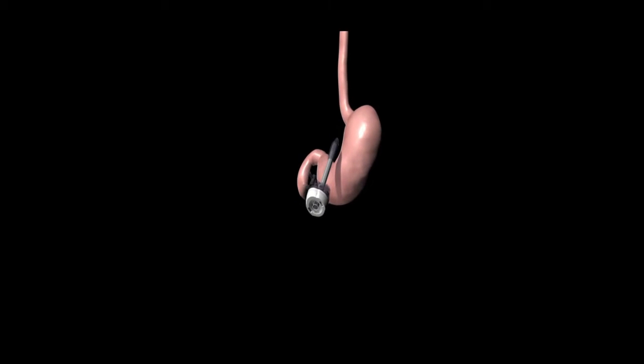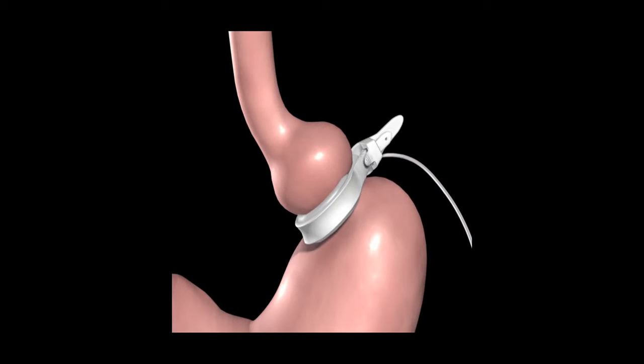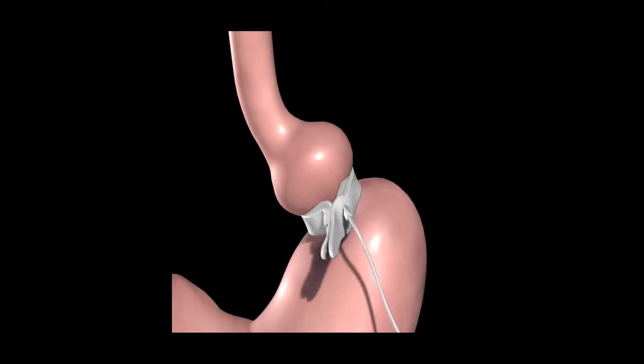In preparation for the band, a tunnel is created behind the stomach. The realize band is introduced to the abdomen through a trocar. The realize band is positioned around the upper portion of the stomach and then secured using the locking mechanism.